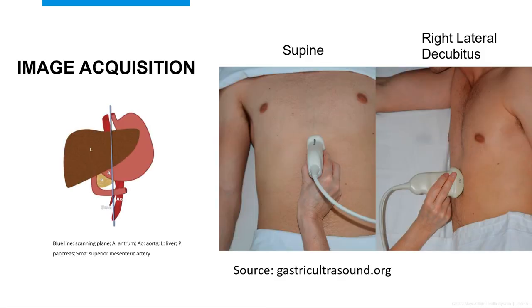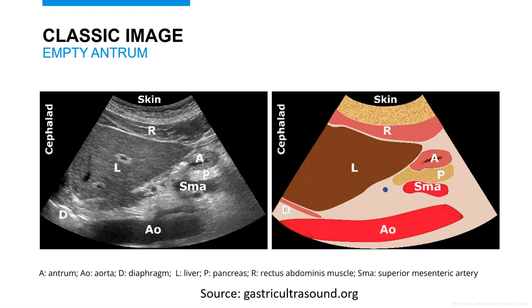To acquire the image, you find the xiphoid process with one hand and place the probe just distal to that. The probe should be oriented in the sagittal plane with the orientation marker pointed cephalad. For gastric ultrasound, we assess the gastric volume and contents in both supine and right lateral decubitus positions. In the image, we can appreciate the liver cephalad, the antrum just distal to the liver, the pancreas deep to the antrum, the superior mesenteric artery deep to the pancreas, and the aorta deep to that. All assessments are performed at the antrum.